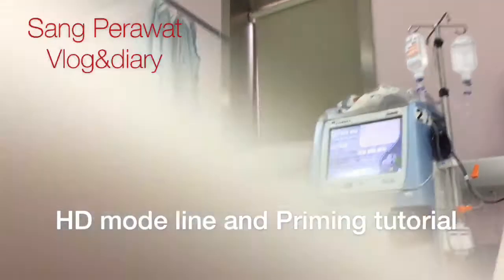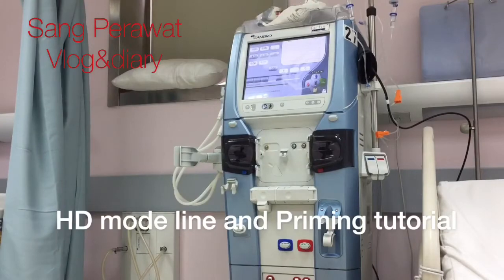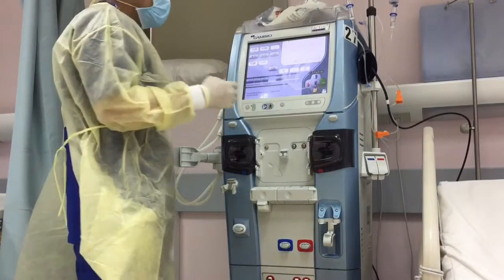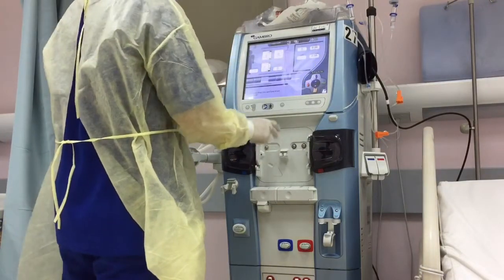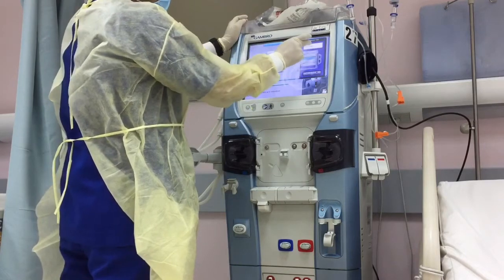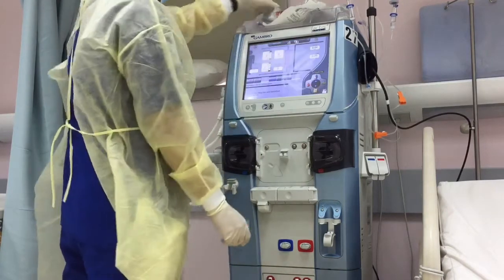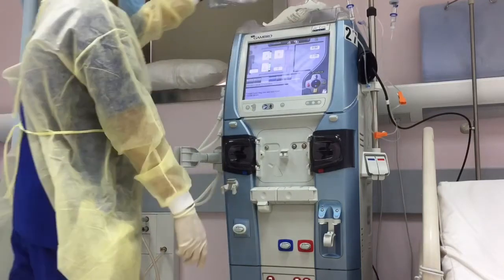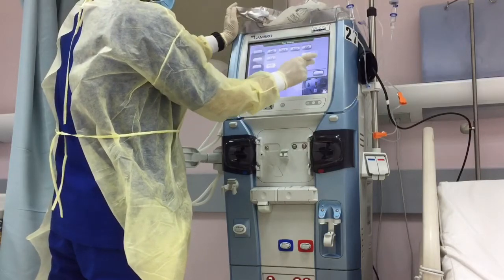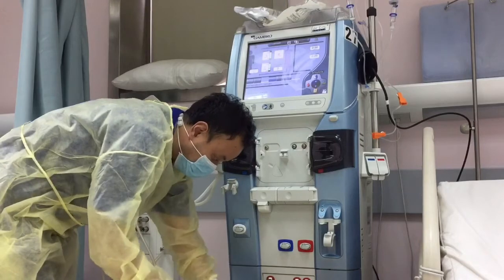Now we are going to put the HD line and we are going to do priming for the HD mode. First, before we switch on the machine, before switching the RTC system on, perform the following check: make sure the power cord is connected to a main supply with protective earth, the machine is connected to the power supply, and that the water is on.